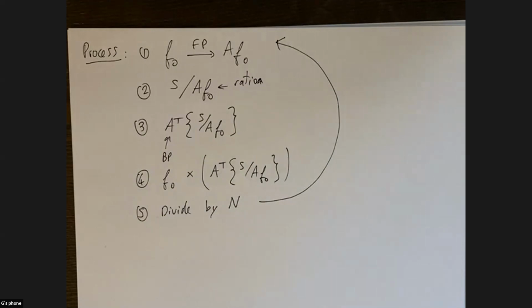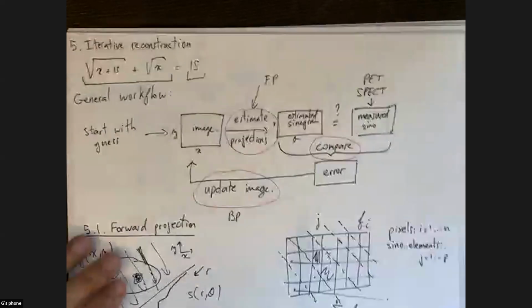The main issue, yeah. Oh, I just have a quick question. Have you already gone through the description for the back projection process, how to assign counts to pixels based on how much the line is intersecting those voxels? Like Siddon's method, that kind of thing, or is that a little extra detail? Yeah, I guess I kind of skipped a little bit over that. I think it's a good point.